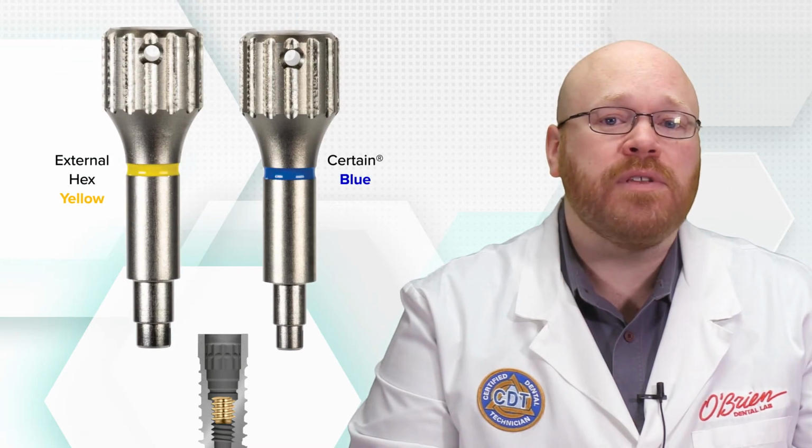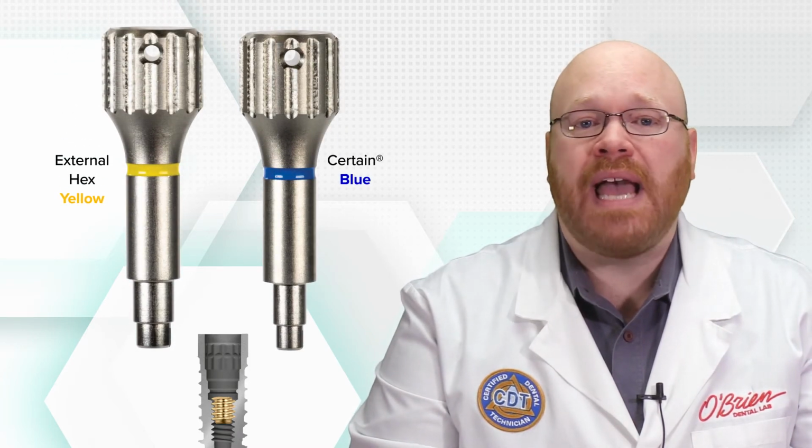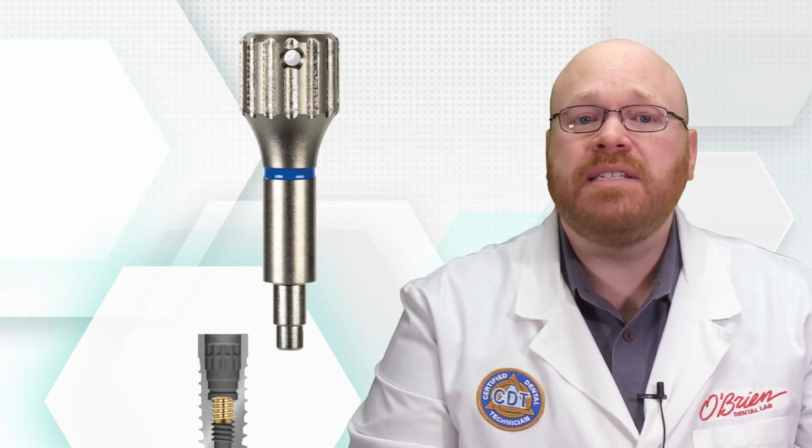You will now use the screw removal tool, which will have a blue band for the certain implants and a yellow band for the external hex implants. Place the tool on top of the broken screw and push down with moderate pressure to engage the screw. With the screw engaged, rotate the tool counterclockwise until the screw is completely disengaged from the implant threads and freely lifts out of the implant.